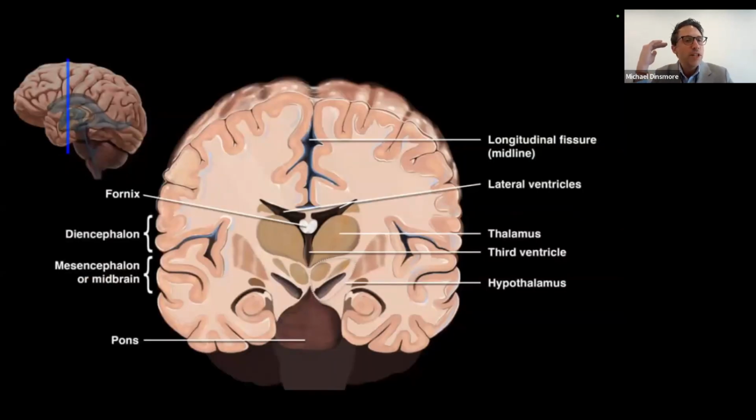So when you actually put this on, what you're scanning across and looking for here is right across the midbrain, so you're cutting up the hypothalamus. If you angle up just about 10 degrees, you'll go into the diencephalon and cross the thalamus and the third ventricle. So have this in mind when you're scanning and looking for the anatomy.